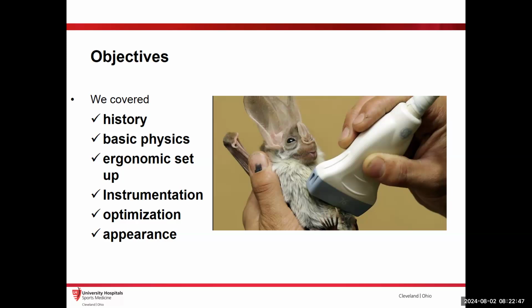And the other thing, you guys that have been working with me, you've heard me say, when we do a hip, I want you to press. When we do a knee or another area, I like you to float on the skin, and that's exactly what Rob told you guys. So great lecture.